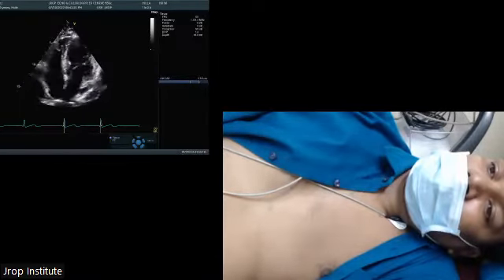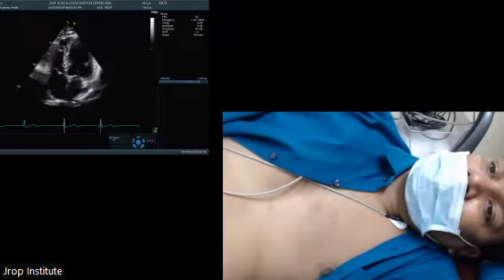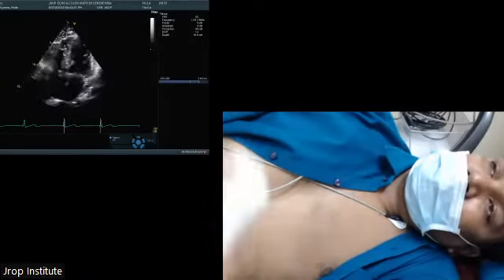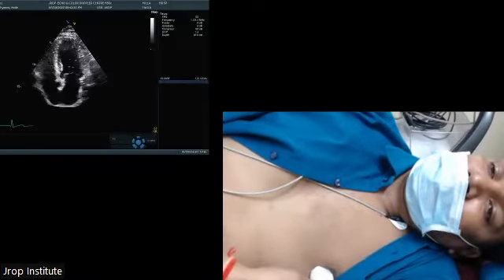Dr. Saurabh, you have to ask something. Yes, sir. Very good evening, sir. I just wanted to ask, how do we adjust, as Dr. Parasha told us, in the Doppler, the baseline and the velocity ranges? I'll be coming to that in a few minutes, but let me do it right now.